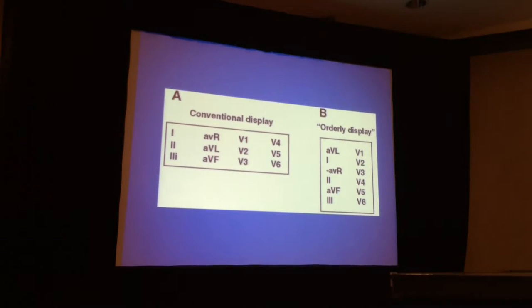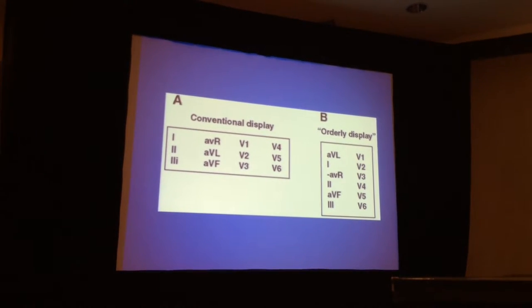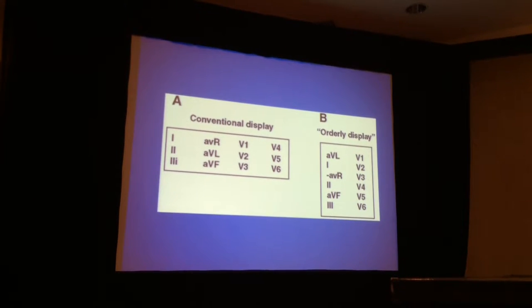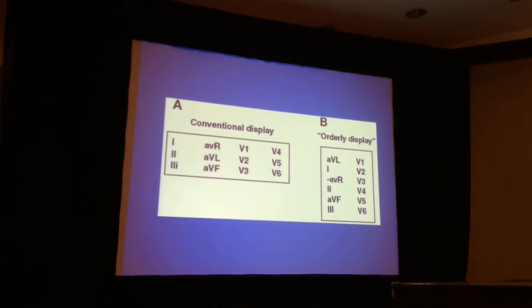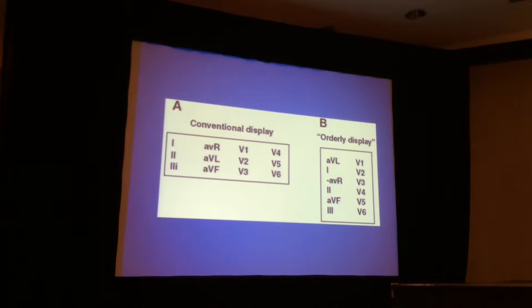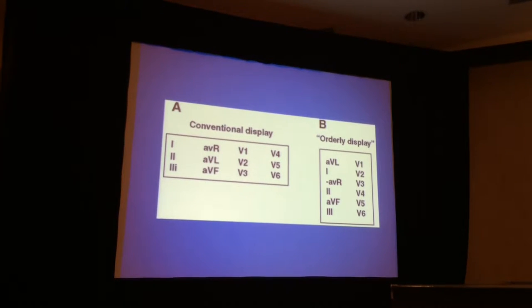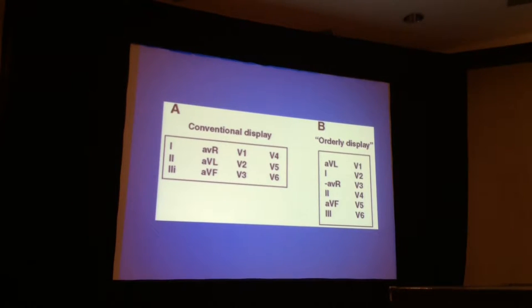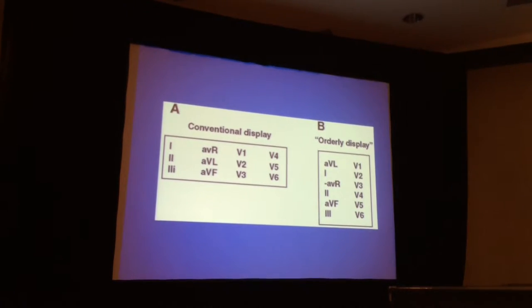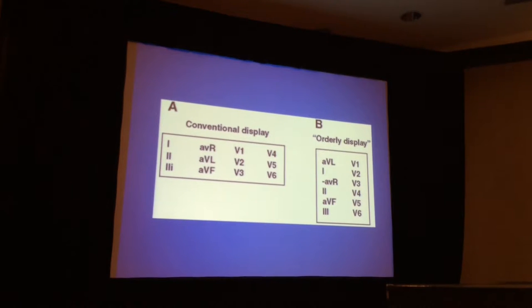I had always looked at electrocardiograms in this display, but when I met Olle in 1988, I realized that in Sweden for the past 15 or so years, they never looked at ECGs by this display. They instead looked at six orderly sequenced limb leads, just as they looked at the six orderly sequenced chest leads, but they did it in this vertical way. So, as you can see, minus aVR fit directly between lead I and lead II, with a typical 30 degrees between each. This was a big surprise to me. I had no idea anybody was so organized.